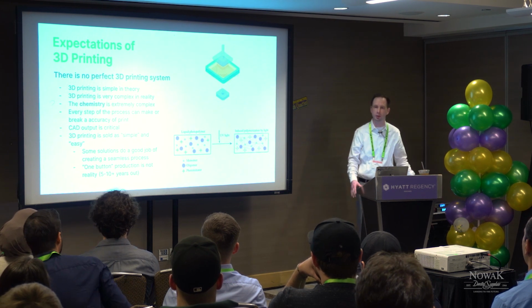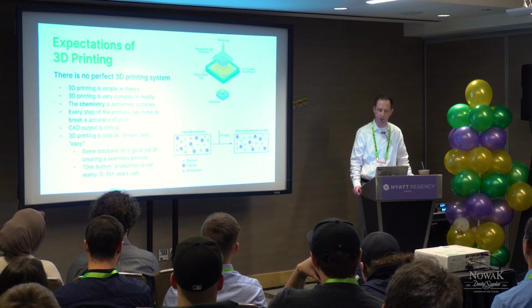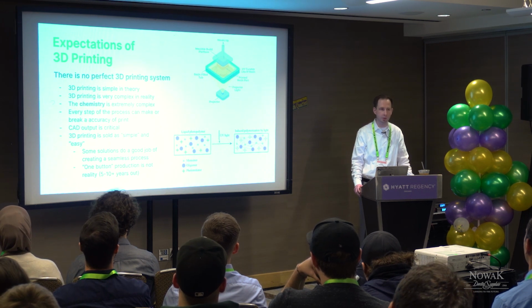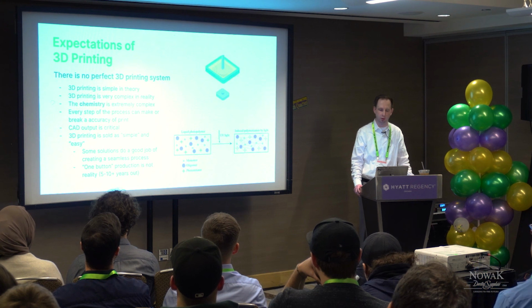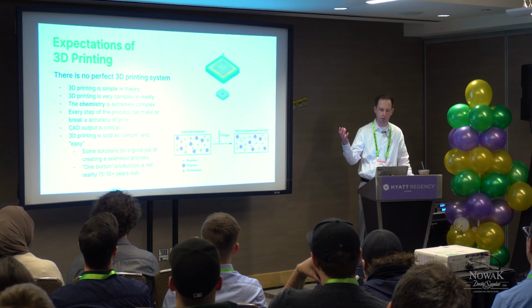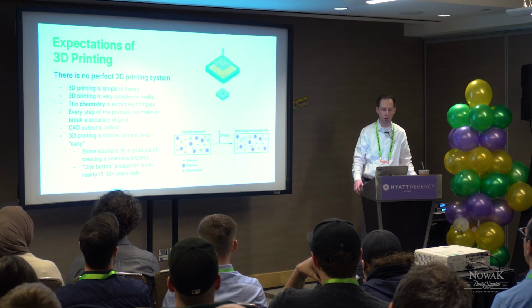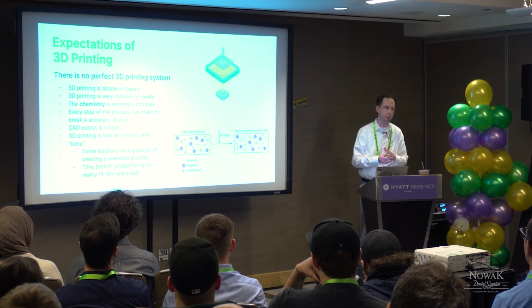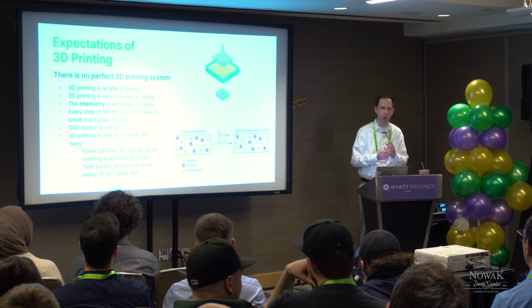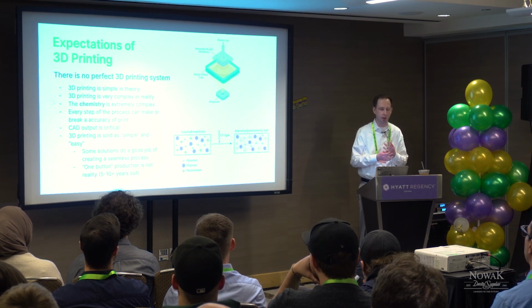3D printing is very simple in theory. You can be sold a process that is magic, but it is not. It is actually very complex in reality, and the chemistry is extremely complex. The transformation of a liquid photopolymer to a solid is very complex chemistry. I worked at Formlabs for 4 years. I worked with material scientists building these polymers from the ground up. The amount of revisions, testing, aging, and toxicity reporting, long-term and short-term, is extremely complex.